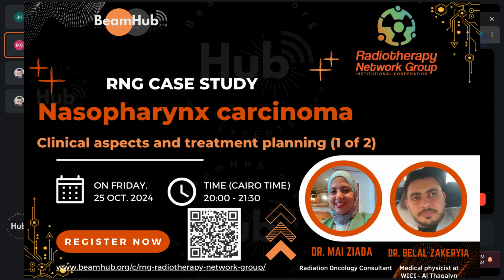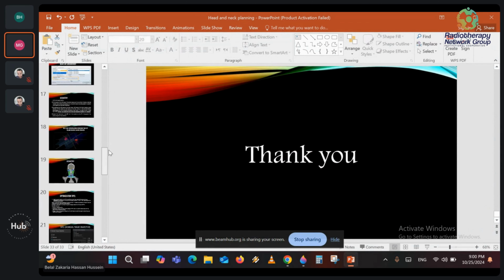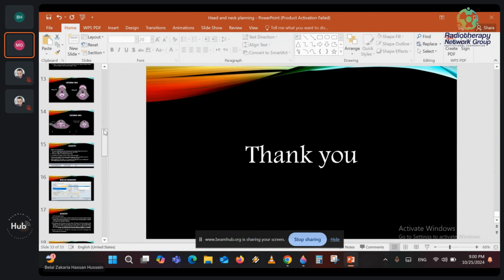I have a question here, Dr. Bilal. In case two arcs don't cover the target and a third arc is used, what should be the starting and ending angles with the collimator angle?